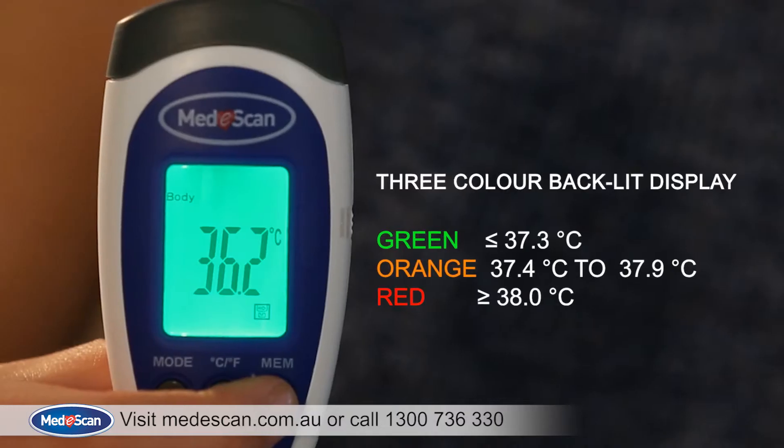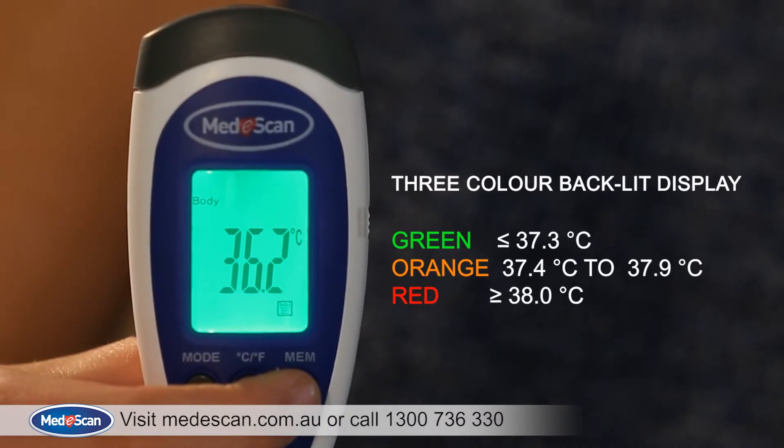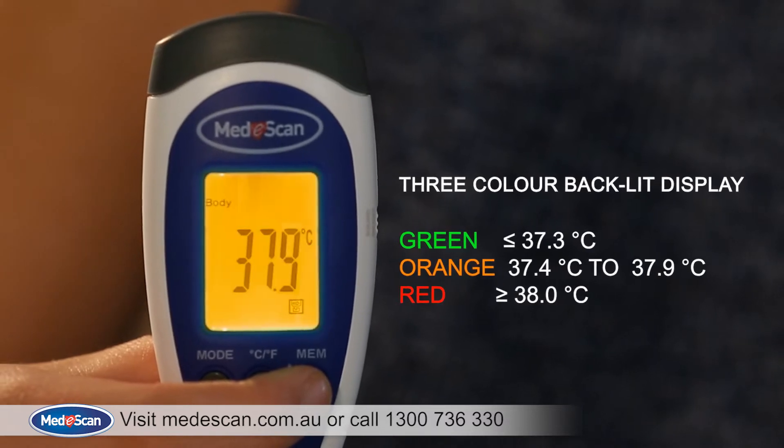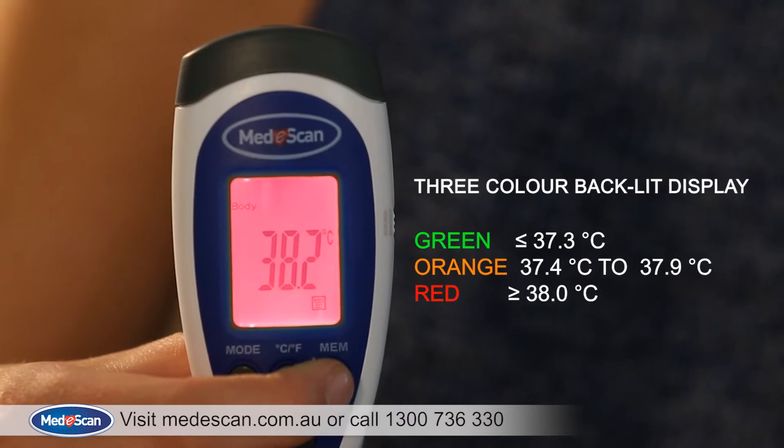The colour of the screen also gives you an indication if the temperature is normal or high. If the temperature is slightly higher than normal, the screen colour will change from green to orange. The screen colour will change to red as the temperature gets higher.